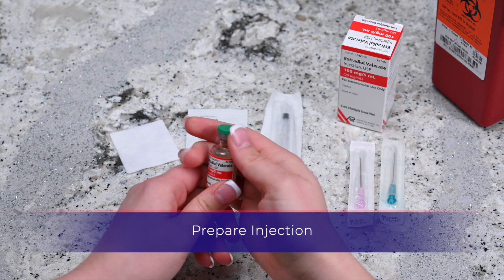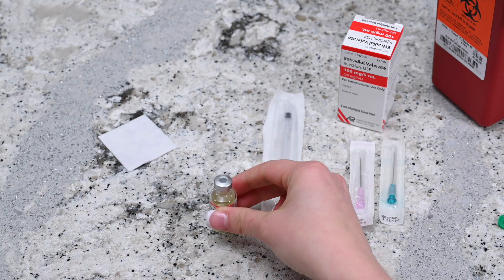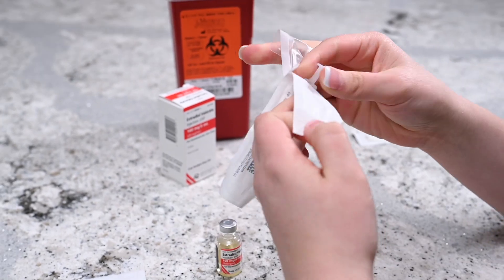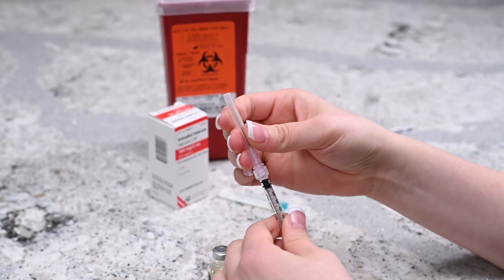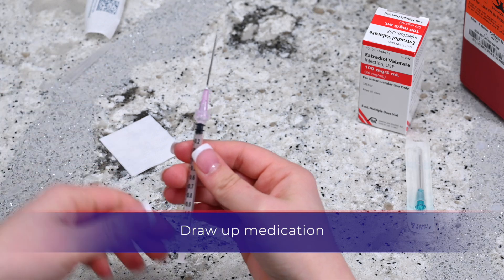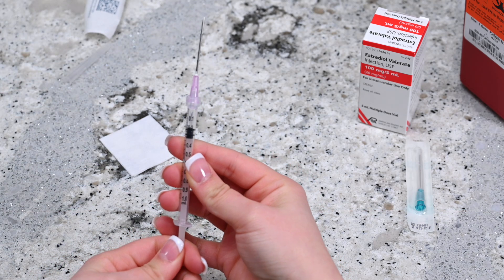Remove the cap from the vial of estradiol valerate and wipe the top of the vial with an alcohol prep wipe. Remove the syringe from packaging, take the 18 gauge needle out of the packaging, and twist the needle onto the end of the syringe. Hold the syringe upright and draw in the same amount of air as the required dose.